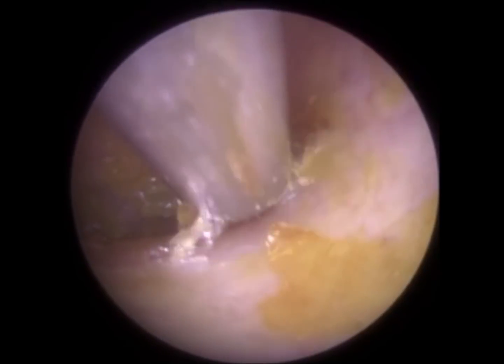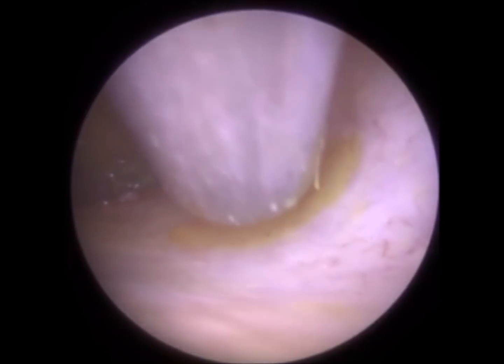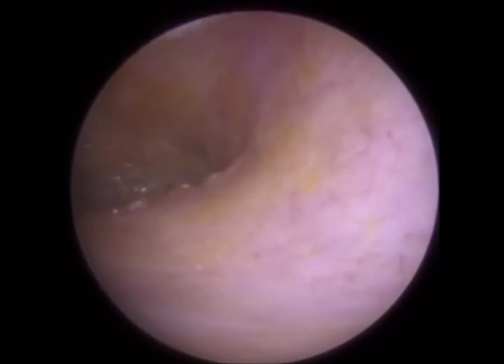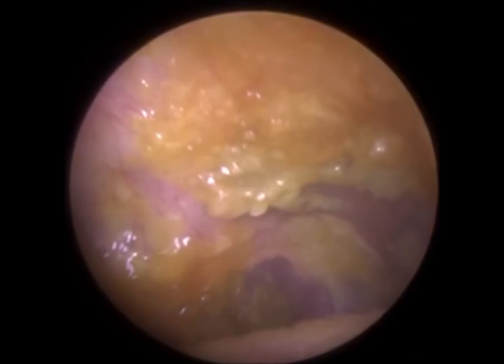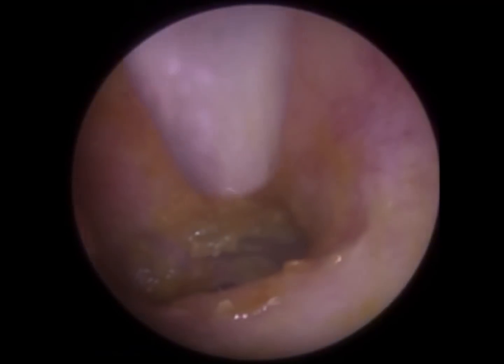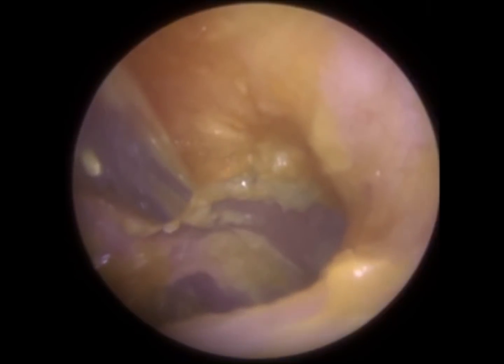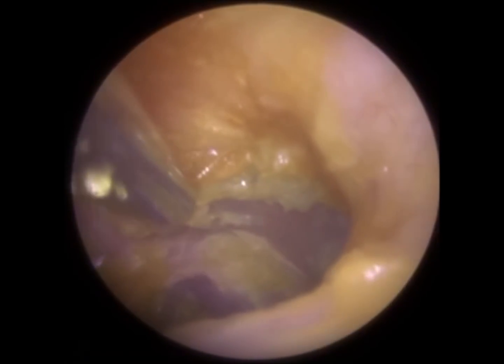If by me trying to remove this wax is becoming a bit uncomfortable for the patient because we had to possibly come in contact with the canal wall, I would have just left it because the symptoms are alleviated. But the patient was okay, so I've just attached a fine end gauge now, so I'm just approaching the eardrum. So it's just some dead keratin, sticky wax posteriorly, just going to be really delicate.